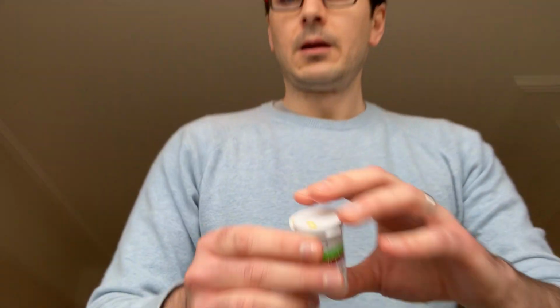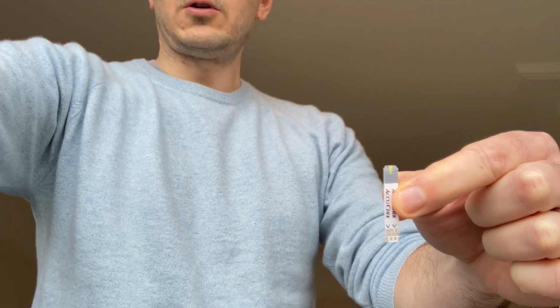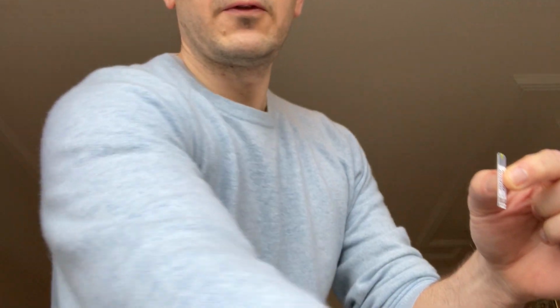Then we have this container with some test strips in there that actually expired 2 years ago, but hopefully will still work. This is what they look like. You see the yellow part on the top. Here is where I will put my blood. And here you can see some electrodes that will just fit right in here, and I will show you in a few seconds.